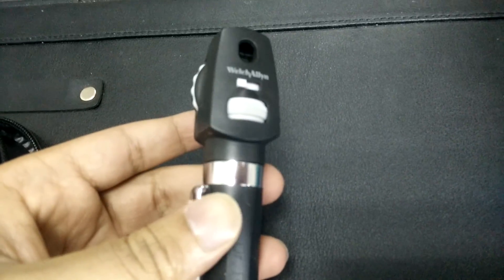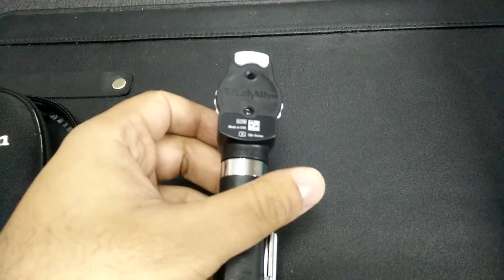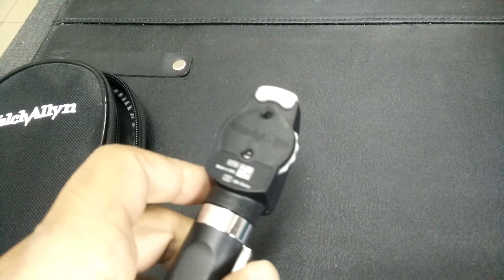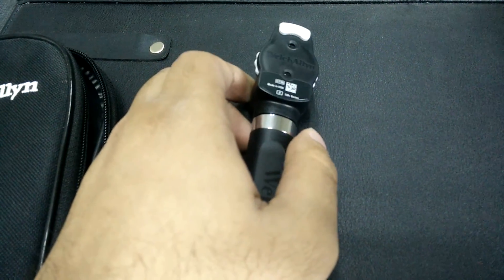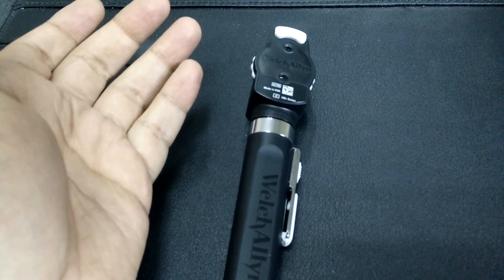The best thing I like about this ophthalmoscope — I have used it for about three months now — is that the illumination it provides is actually very clear. It is an LED illumination, hence it is very easy on your battery. According to the official website and the brochures, you don't need to replace this LED bulb, and it has about a lifetime of 20,000 hours.